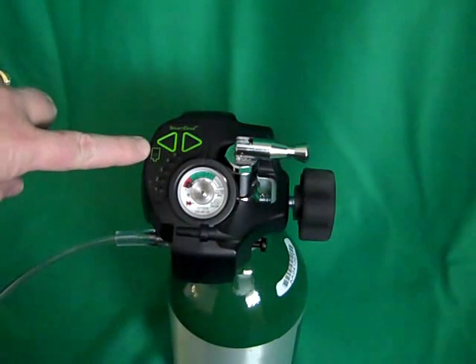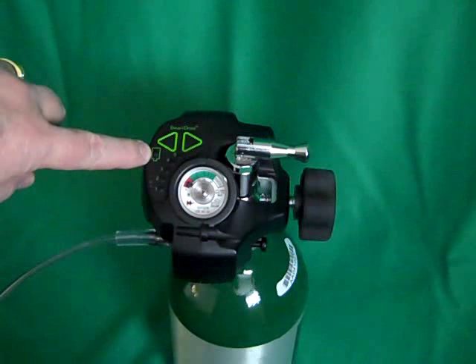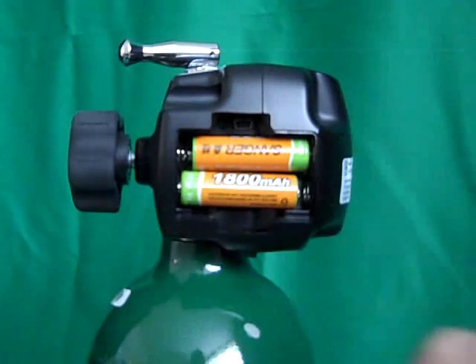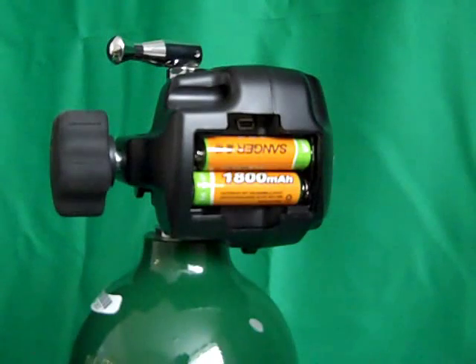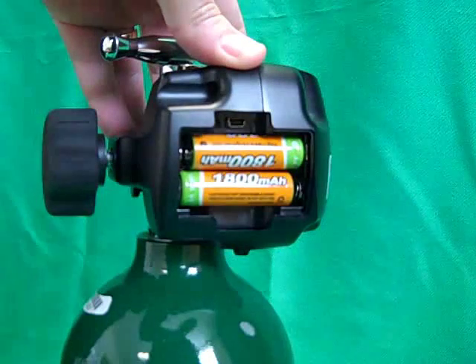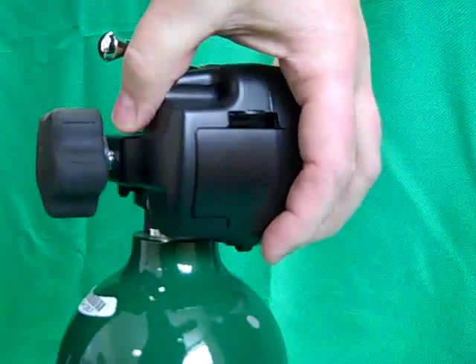In the event that the batteries get low, the red low battery indicator on the front label will flash with each breath, and then will turn solid red when they are too low to operate the unit. Each unit is shipped with rechargeable batteries and a charger. In typical use, the batteries will need to be charged every four to five days. To charge the batteries, open and remove the battery door by pressing down and away on the tab. Plug the charger into a 120 volt AC receptacle and then plug the mini USB plug into the connector above the batteries. A solid red light indicates that the batteries are charging. When the batteries are fully charged, the light will go out. Simply disconnect the charger and reinstall the battery door — place the bottom of the door in first and then swing the door up and push it to latch it in place.